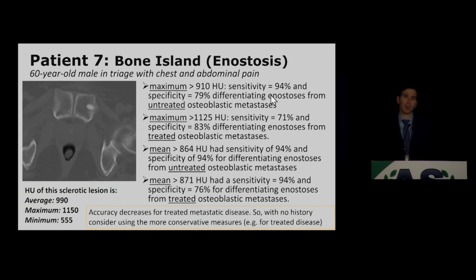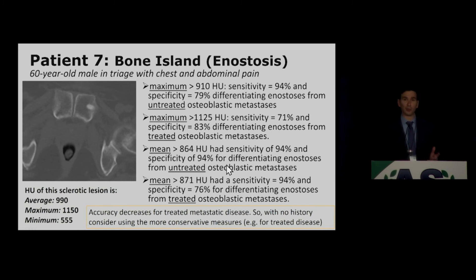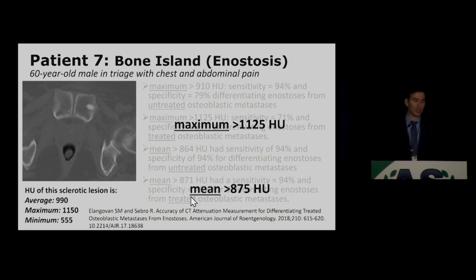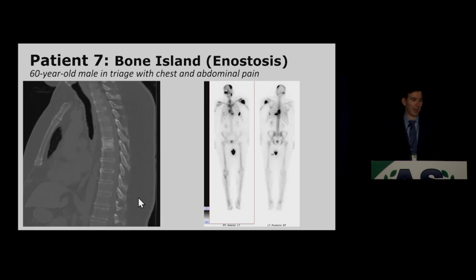Patient 7 highlights recent papers on differentiating bone islands from sclerotic metastatic lesions using Hounsfield units. At the workstation, a maximum Hounsfield unit value greater than 1125 or a mean greater than 875 is indicative of a bone island. You can fine-tune these values to your practice. This did end up being a bone island at long-term follow-up, even though this patient had a history of prostate cancer.